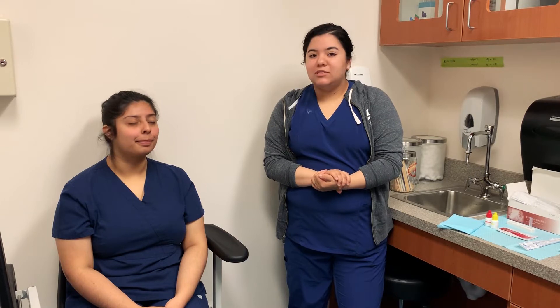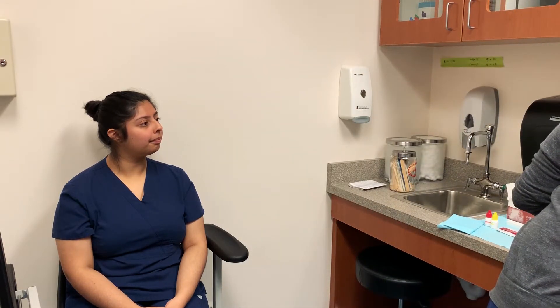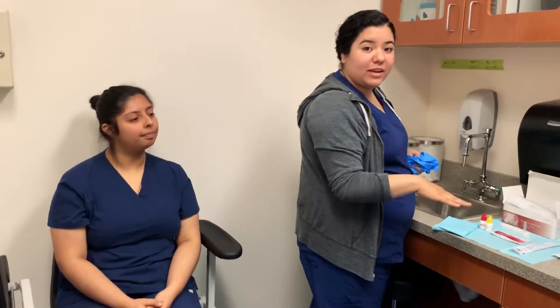Hello! Today we're going to be doing a rapid strep test on my lovely Maite. This has a couple of steps to it, so as I'm doing it I'm just gonna show you along the way. First I'm gonna put on my gloves. I already have everything that I need for my strep test right here.